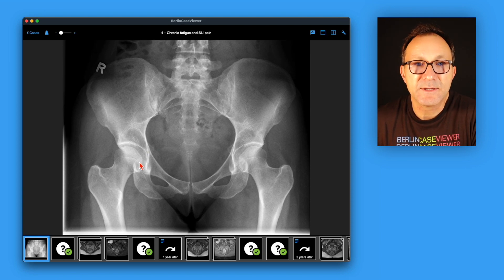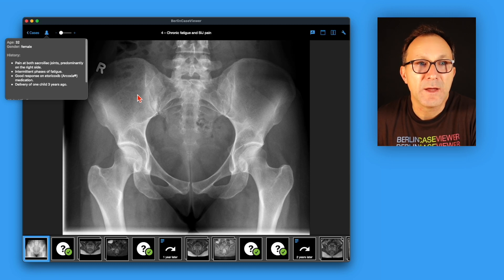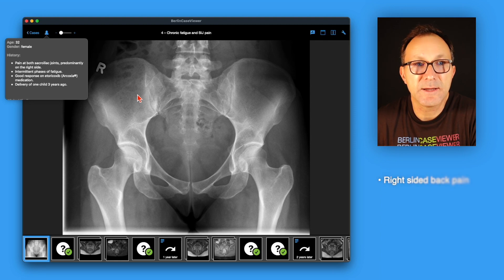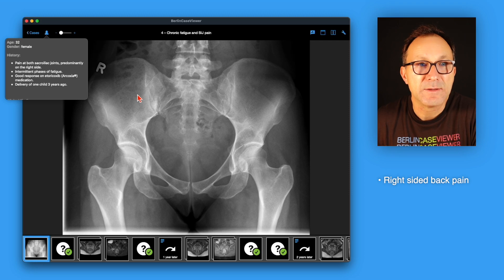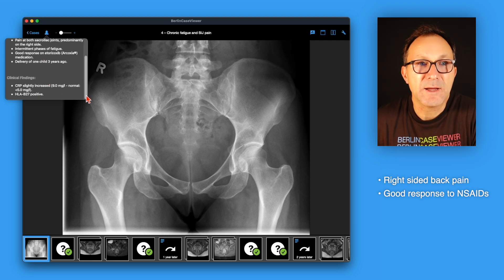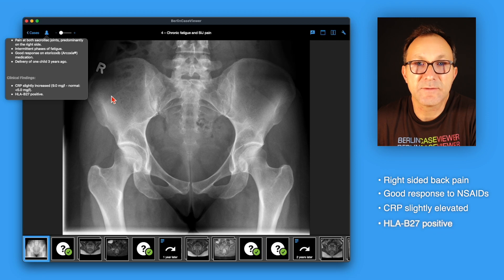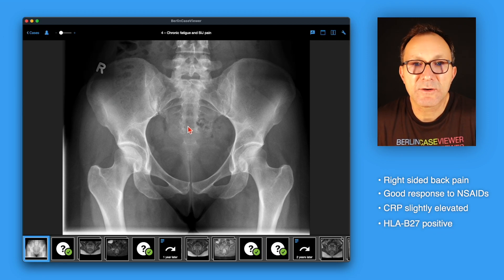This case starts with an X-ray of the pelvis, but let's first check the medical history of this patient. This is a 32-year-old woman who presented with sacroiliac pain in both joints, predominantly on the right side at first presentation, and she also presented with intermittent phases of fatigue. There was good response to NSAIDs, and it's also important to note that 3 years ago she delivered a child. The CRP is slightly increased at 9 mg/L, and HLA-B27 was tested positive.